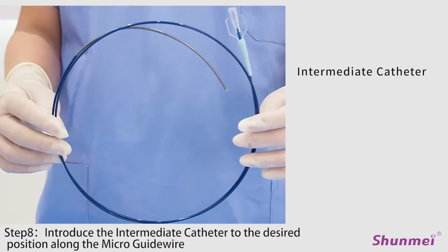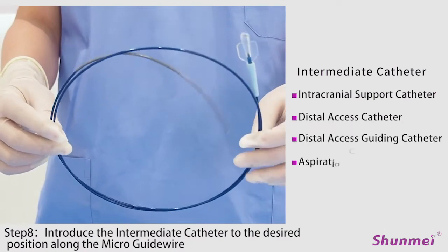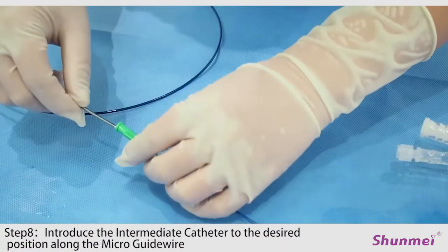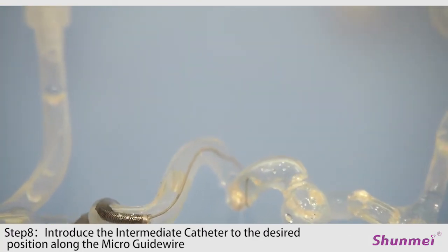Next, insert the intermediate catheter. There are many names for intermediate catheter: intracranial support catheter, distal access catheter, distal access guiding catheter, and aspiration catheter, all of which refer to intermediate catheter. Through the micro guide wire, the intermediate catheter goes up from the inner lumen of the guiding catheter, advanced to the desired position to be fixed.